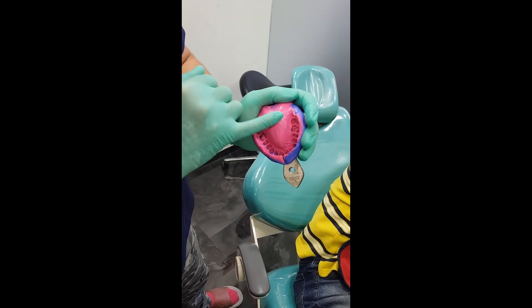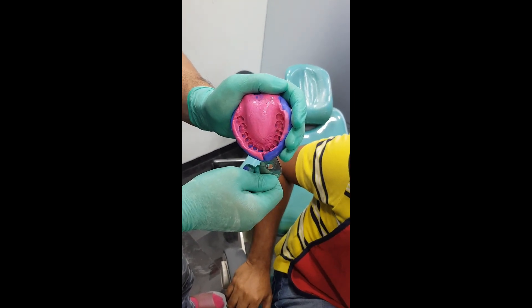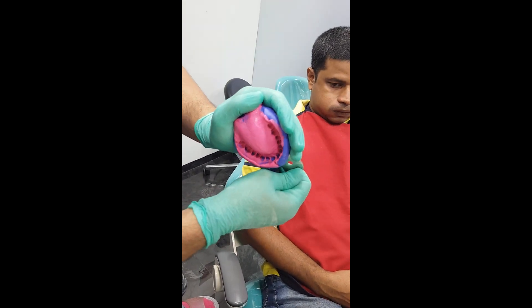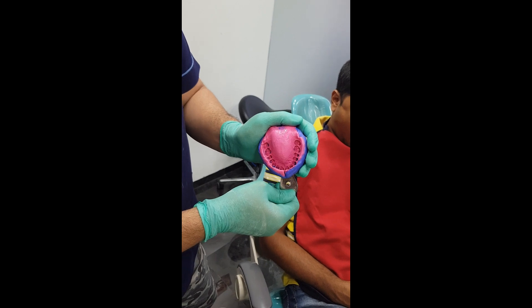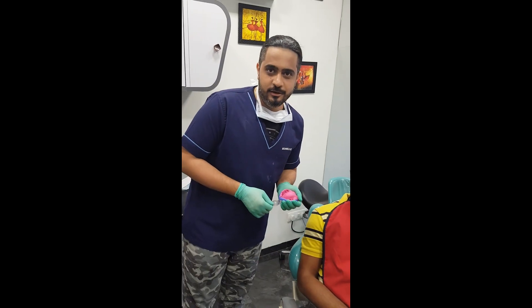You can see the entire palatal mucosa has been recorded as well. This is a very nice impression for a diagnostic cast pouring. So the one and a half step technique, friends, works brilliantly for such impressions. Please make sure you do not follow this technique for your crown and bridge dentistry. Thank you.